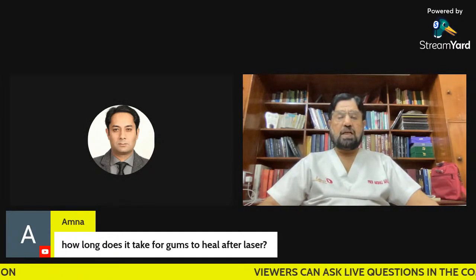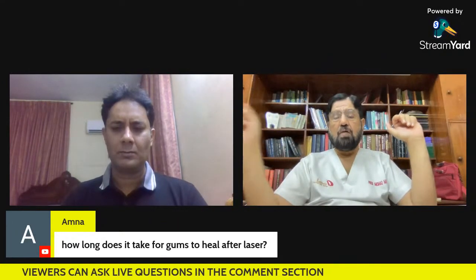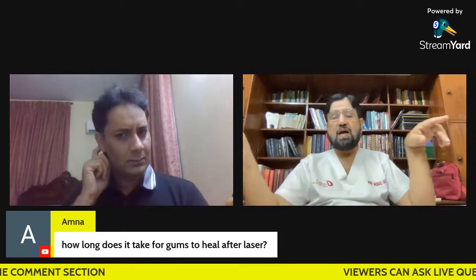The question is broad rather than precise. Gums can mean gingivectomy, surface ablation, or crown lengthening. There are different procedures, and according to the procedure, the healing period is decided. When you have only surface ablation, it heals in 4 days, while routinely it used to heal in 7 days. When you cut with the laser, it heals in 5 days, while routinely it used to take 7 to 8 days.